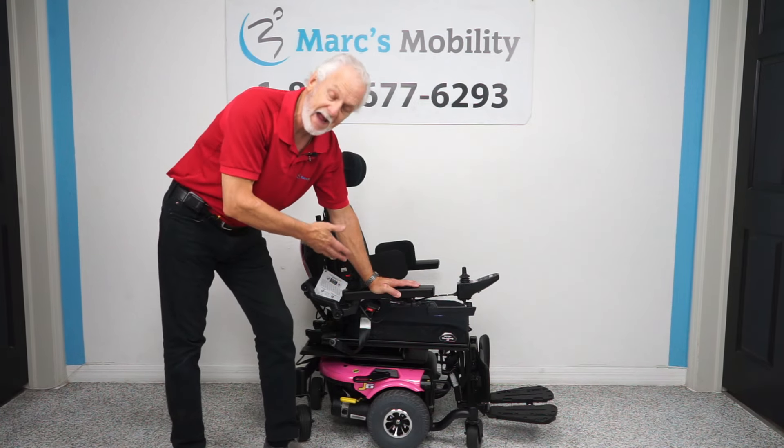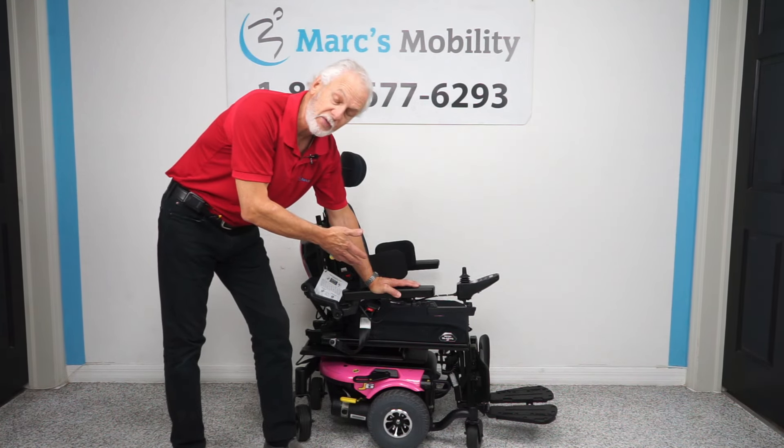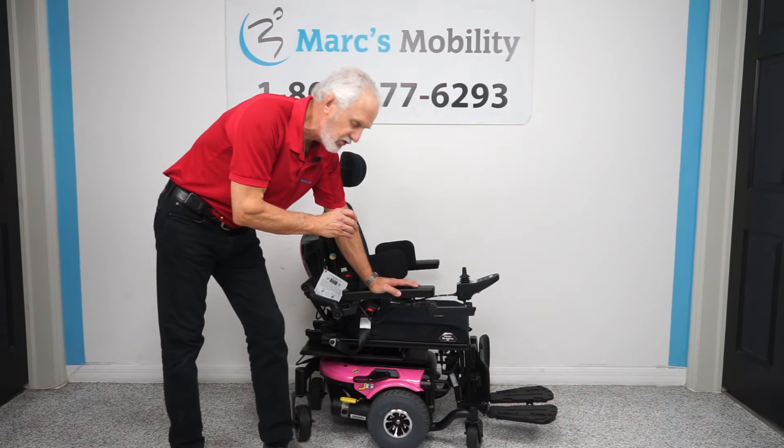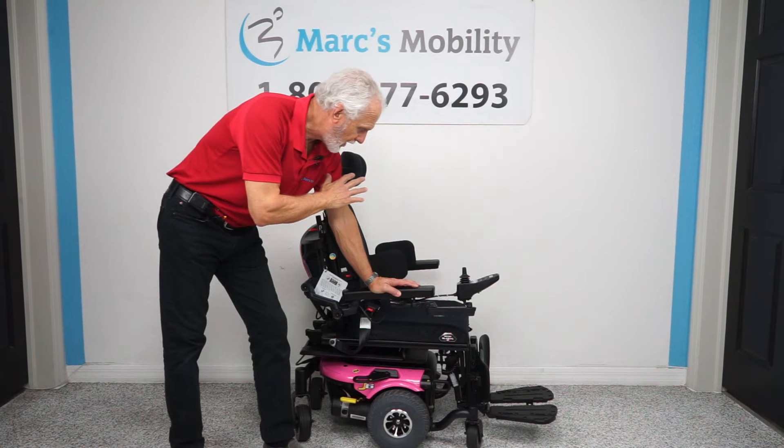Now this chair is pink. We can definitely make a different color if you need a different color on here — that is a possibility. This chair is literally brand new; it was used for about three months. Practically brand new.